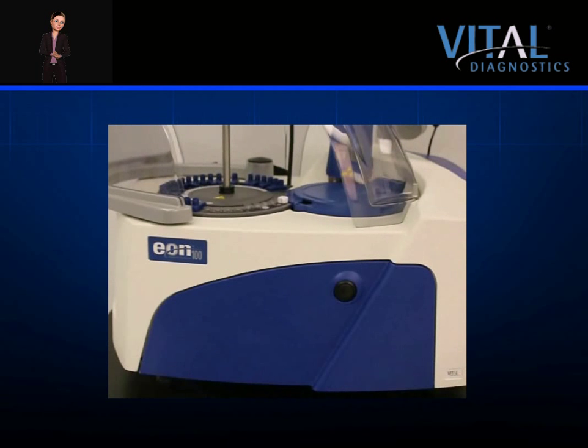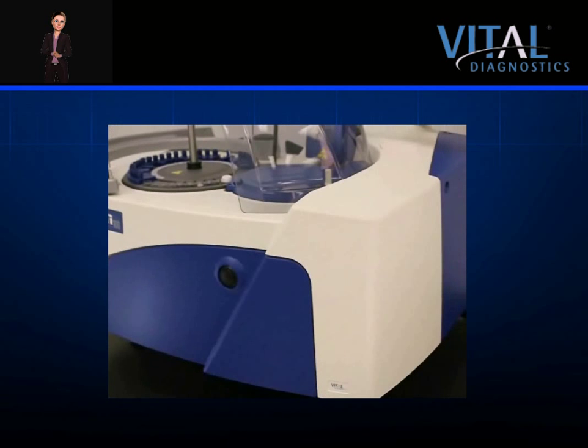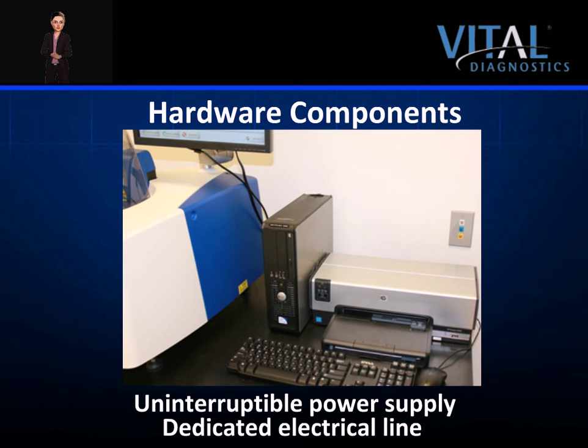Five linear feet is recommended for adequate workspace and proper storage of the computer equipment. The computer system included with the analyzer comes complete with a printer, which is strongly recommended. The system utilizes a dedicated electrical line and an uninterruptible power supply.